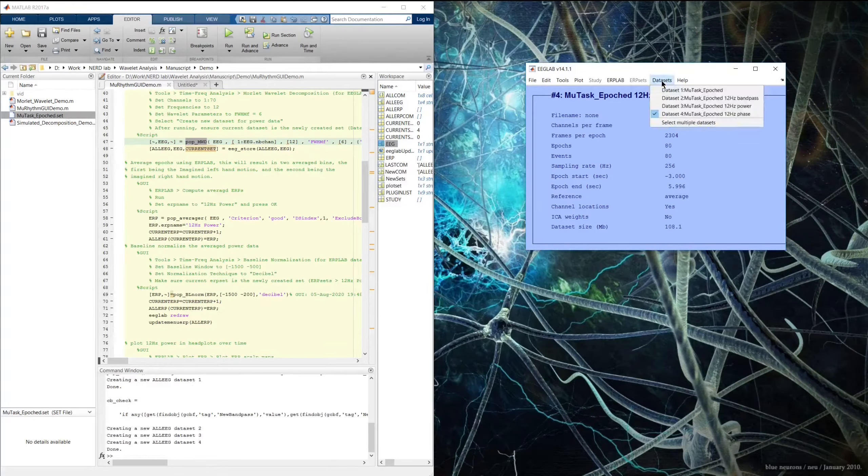I'm going to convert to decibels and press OK. Now we have a new ERP set named '12hz decibel,' and we've actually already calculated the mu rhythm ERD — all that's left is to plot it. ERPLAB has great plotting functions for averaged bin data. I'll use Plot ERP Scalp Map to get a visualization of the mu rhythm ERD over the head and over time, plotting from negative 500 milliseconds in 500 millisecond increments to 4 seconds in. I'll select none for baseline correction since we've already baseline corrected to decibels, switch to map view, and set the range to negative 6 to positive 6 decibels.